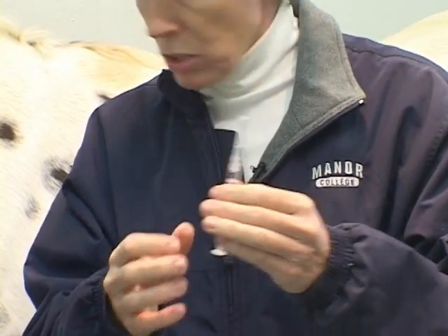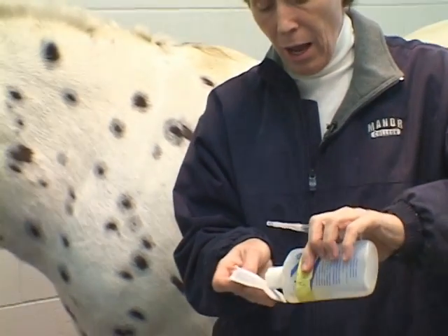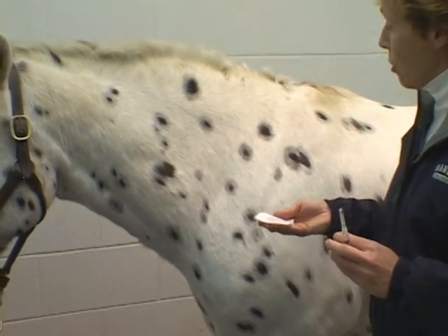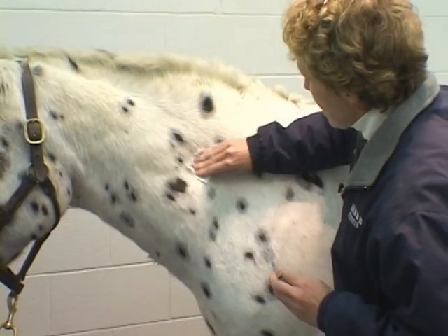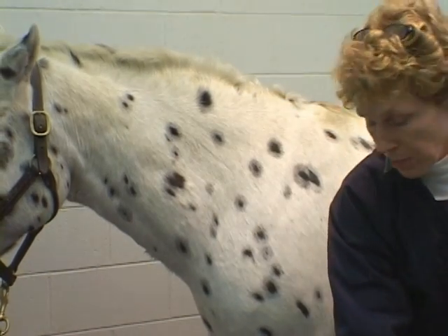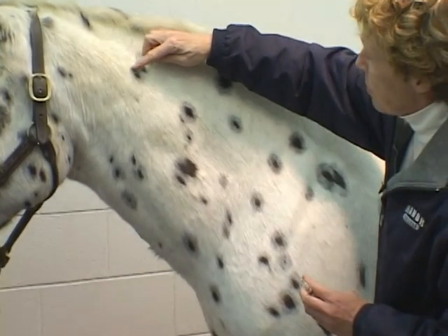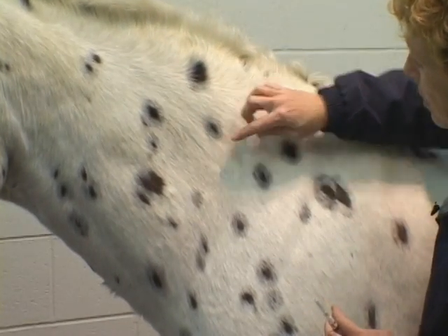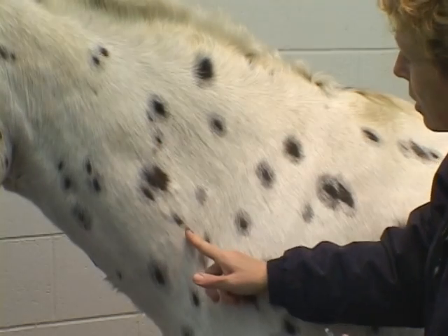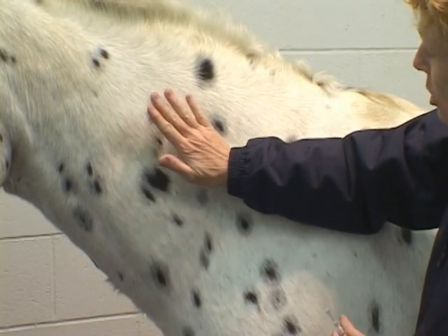I'd like to do just a little bit of an alcohol swab on Checkers' neck. Checkers is a pretty clean guy, but mostly in large animal practice you're just trying to get the worst of the gross dirt off, so we'll swab off a little place. Anatomically, where I'm going to go is beneath the nuchal ligament, in front of the scapula, and above the spine — so I've got my little triangular section right there.